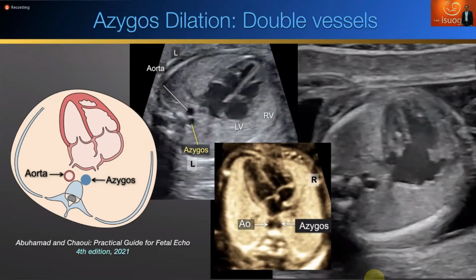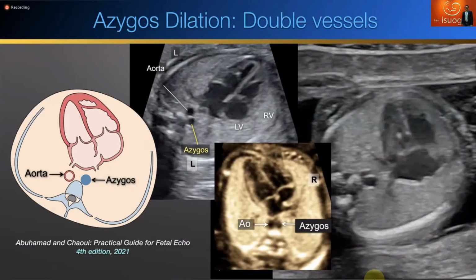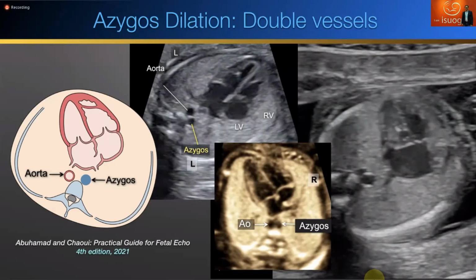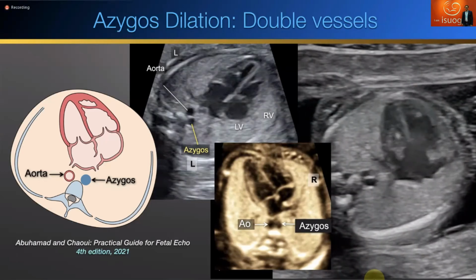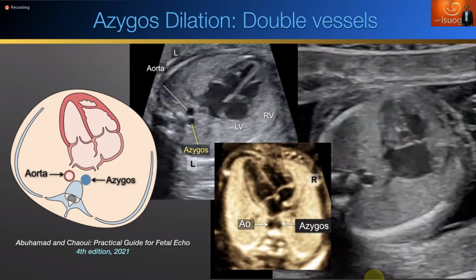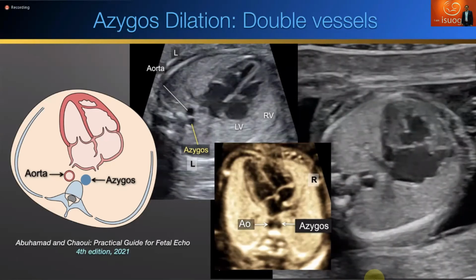And this is present typically in left atrial isomerism, or what is called polysplenia syndrome. In these cases, they often have AV canal. So the beginner or the basic person would say, I see the heart is bradycardia. The professional will say, I recognize AV canal in combination with a white spot, an echogenic focus. It could be Down syndrome.